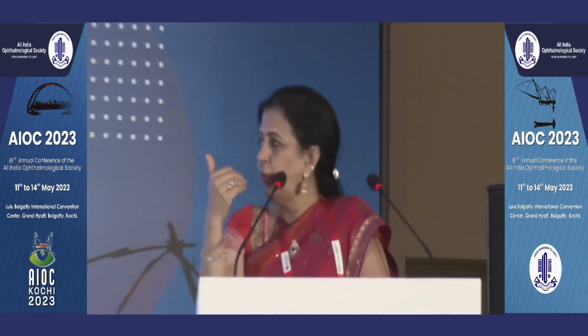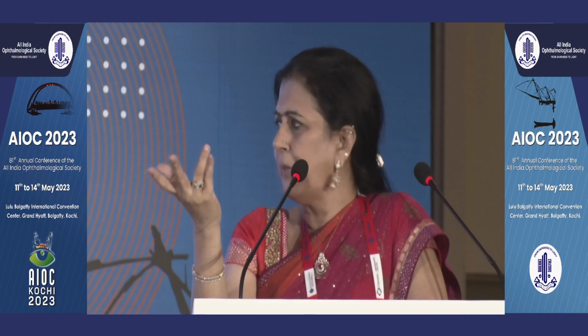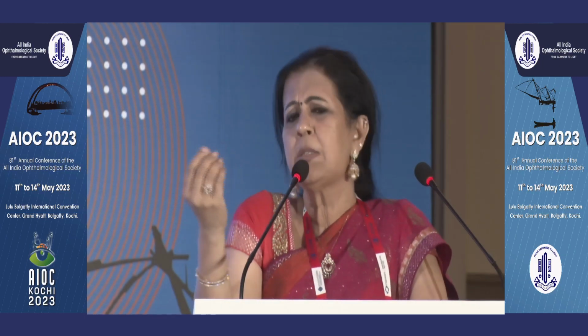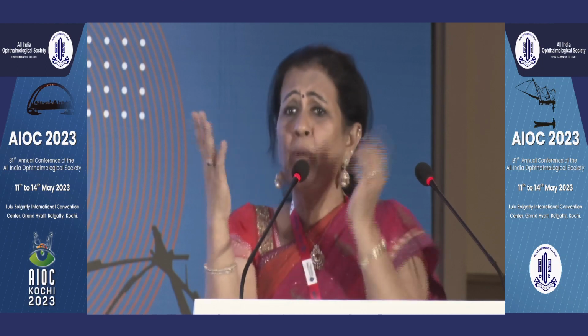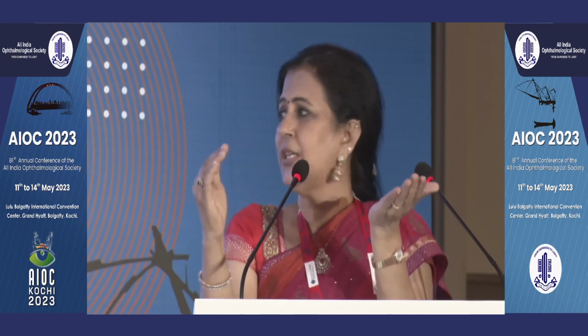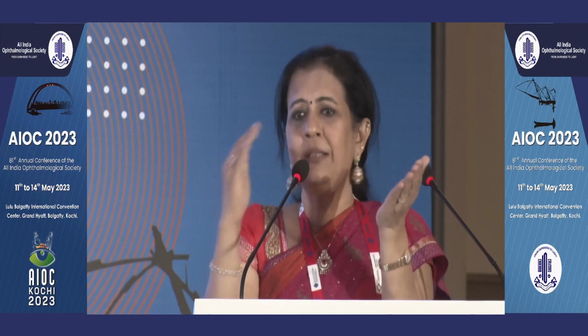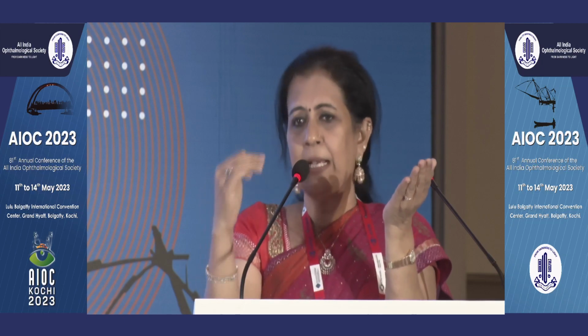You devise a nomogram. And in our particular machine, over the 10 years we've been doing SMILE, we were constantly getting good results, with some unexplained small astigmatism. We have corrected even up to 3 and 4 diopters of astigmatism in SMILE and had great results. But there were some eyes which had small errors. In Contoura, in that batch of 200 eyes, it appeared that Contoura was faring better in higher astigmatic errors as against SMILE.